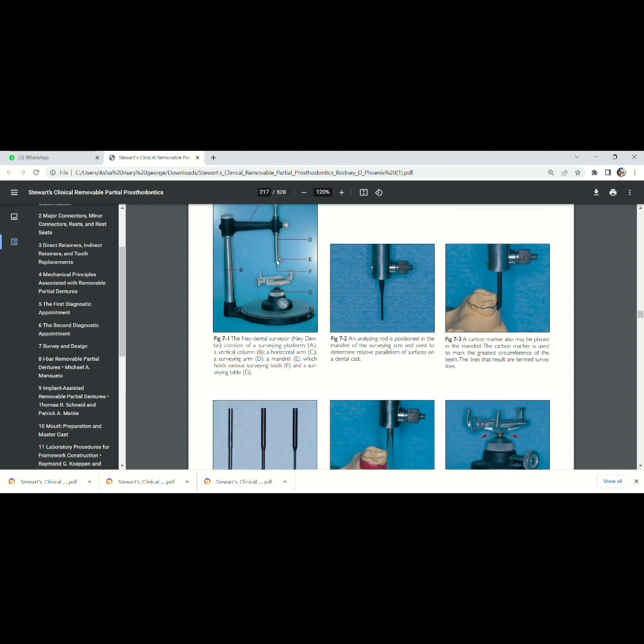And this is the cast holder. And here you can see the surveying platform. The cast holder can be tilted anteriorly, posteriorly, right lateral and left lateral using this screw.